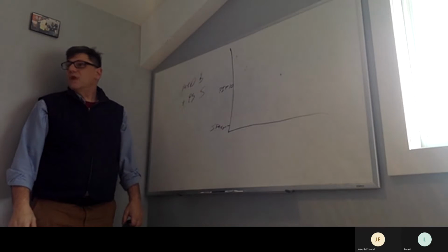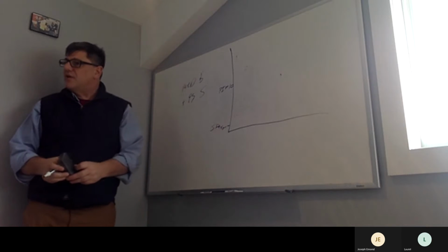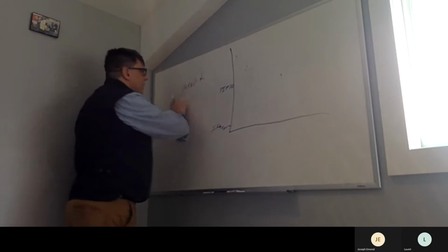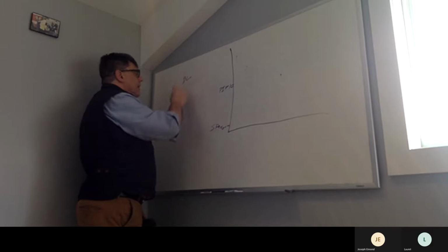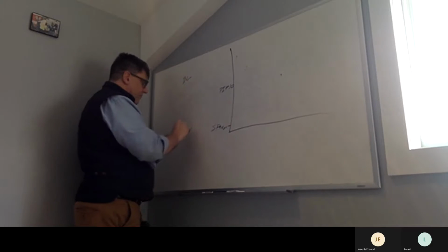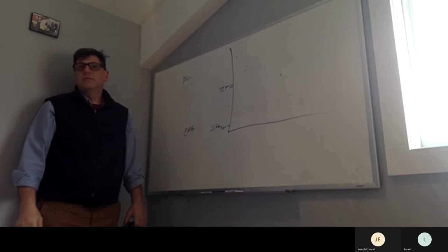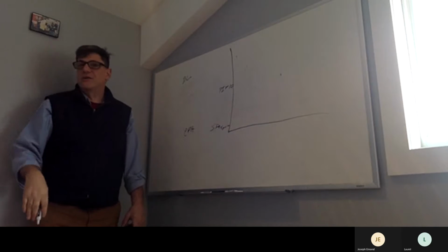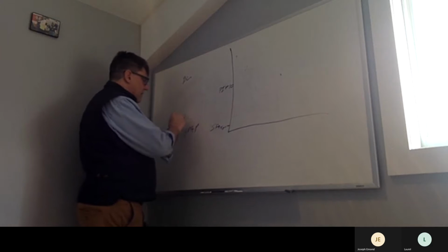Once you start up in mask CPAP mode, and then you go to the Emerge, if you want to talk the same language as they want to talk, you can change the mode to BL mode. And BL mode will give me EPAP and IPAP. What is EPAP? Bottom pressure.